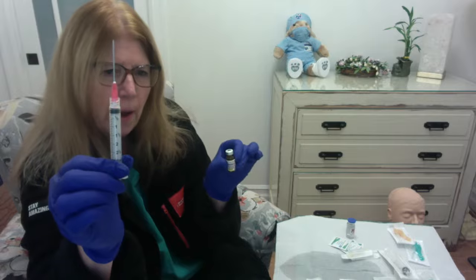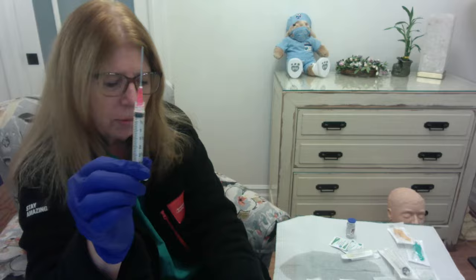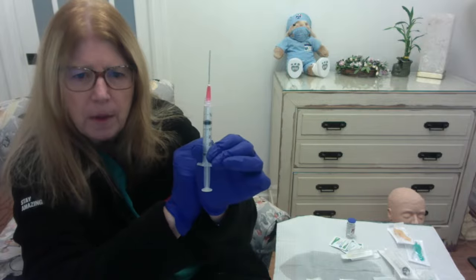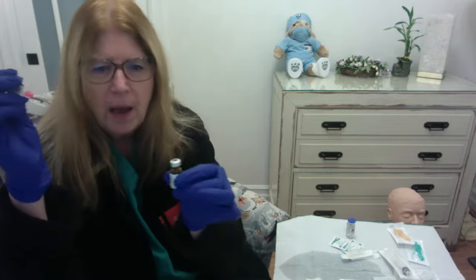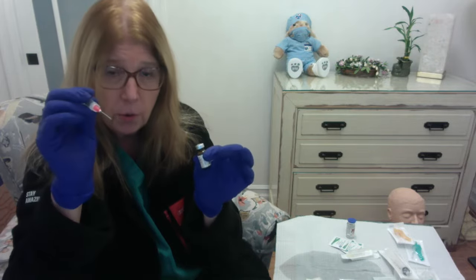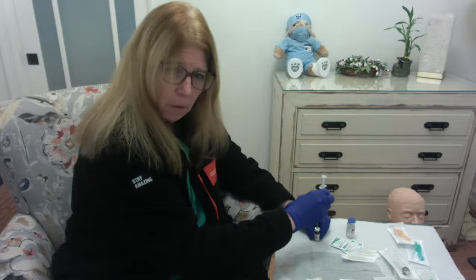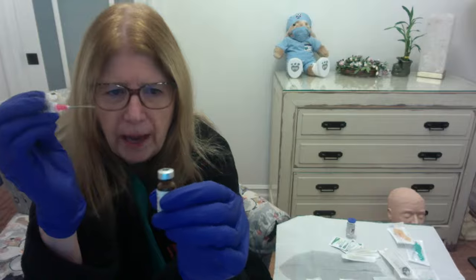All right, so my alcohol has dried. I need to draw out 1 milliliter of this medication from here. So my first step is I'm actually going to draw back 1 milliliter of air. And there we go, 1 milliliter of air. I'm going to be holding this up in the air, but I want to tell you that you will have the vial on the table when you put your needle in, okay? I'm going to hold it up just so that it can be a little closer to the camera.